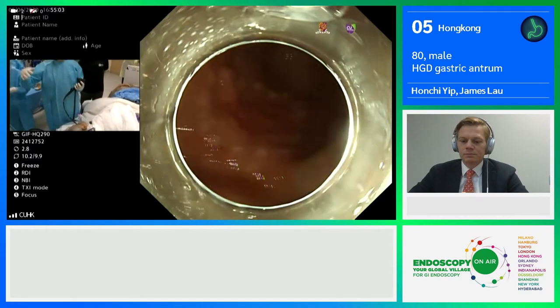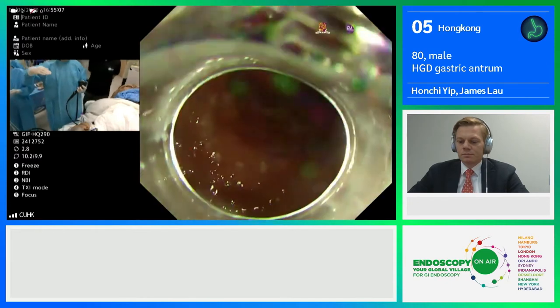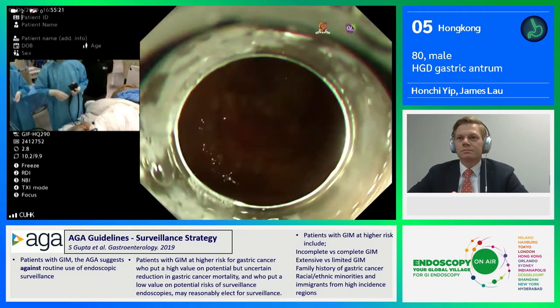Gravity is helping you, because once you perform the initial cut with a mucosal flap, the flap will raise up towards the proximal part of the stomach. I will start injection from the far side and then go back to the near side.